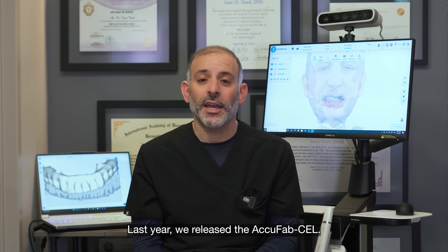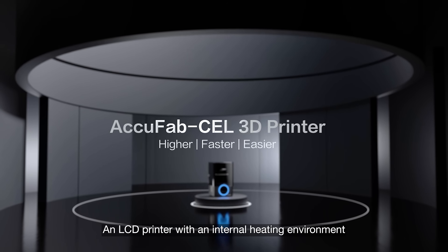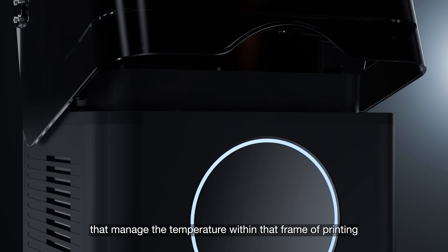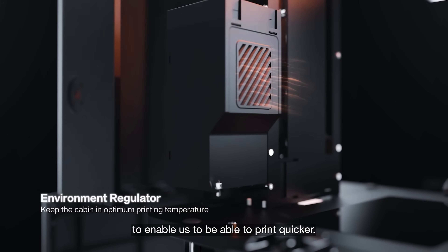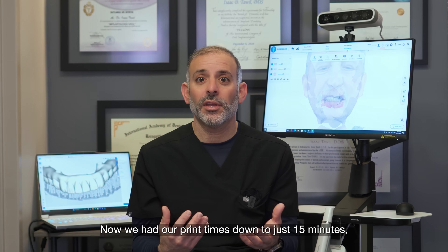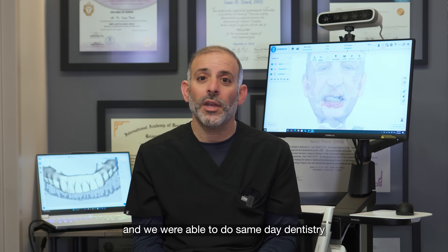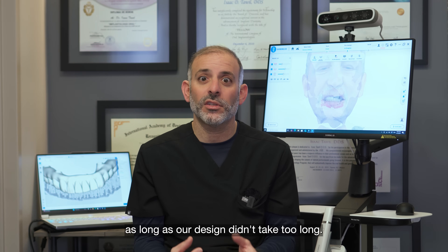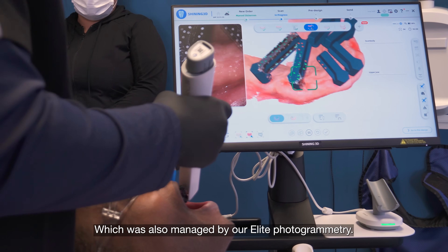Last year we released the AccuFab-CEL, an LCD printer with an internal heating environment that managed the temperature within that frame of printing to enable us to print quicker. We had our print times down to just 15 to 20 minutes for models, and we were able to do same-day dentistry, which was also managed by our elite photogrammetry.